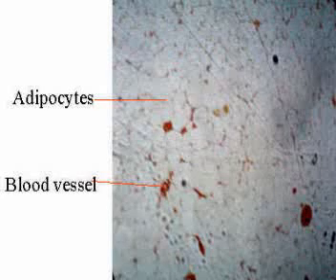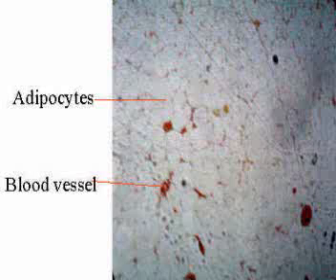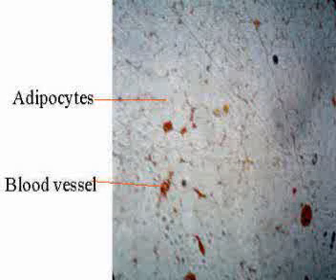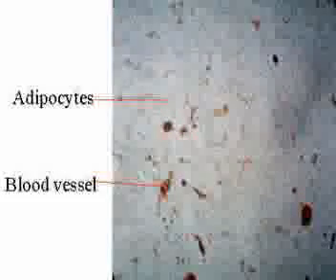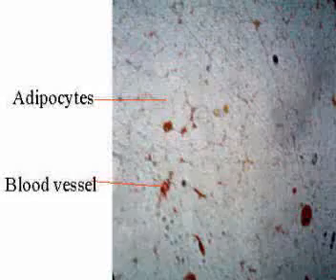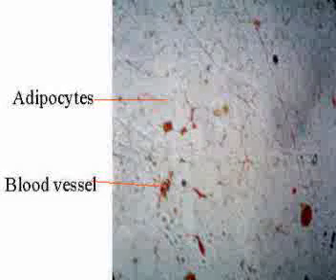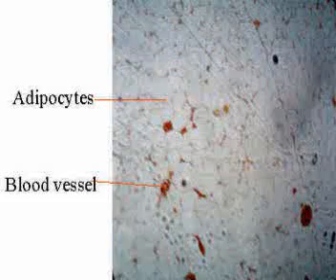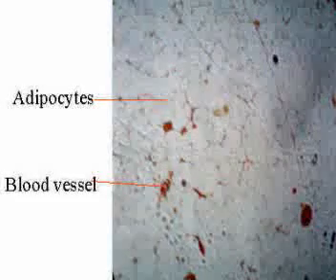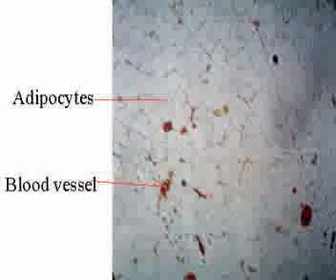Globules in a single gland. They tend to fill the whole cytoplasm, thereby pushing the nucleus of the cell to the side. During tissue processing, the fat globules dissolve out of the cells, and the cells now appear with holes which are characteristic and therefore diagnostic of adipose tissue and their contained adipocytes. For differential diagnosis, adipocyte cells have holes as a result of the fat globule removed during tissue processing.